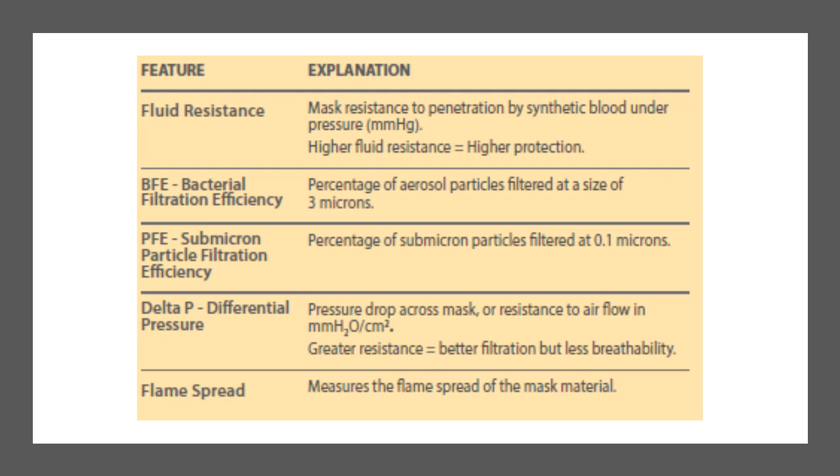mask. First is the fluid resistance, which is the ability of the mask to prevent penetration of any liquid material, especially blood or oral secretion. Higher the fluid resistance, higher is the protection.